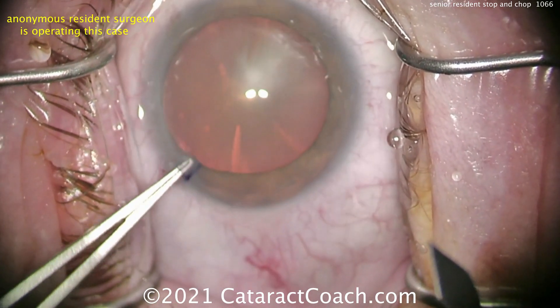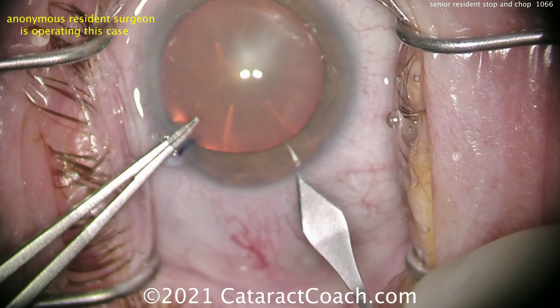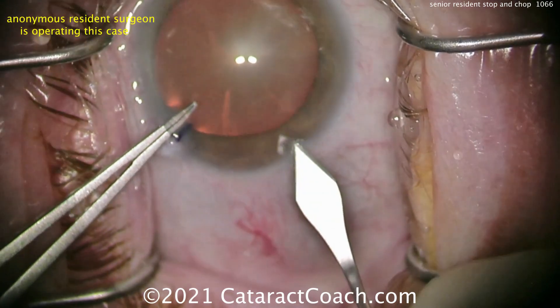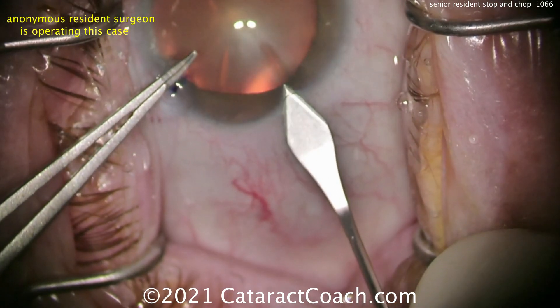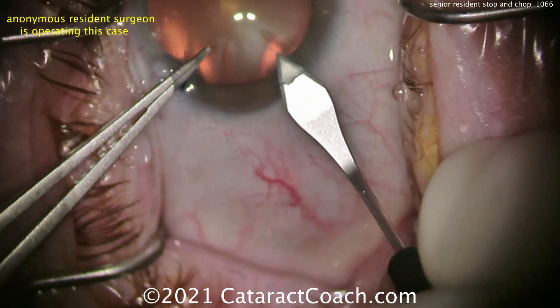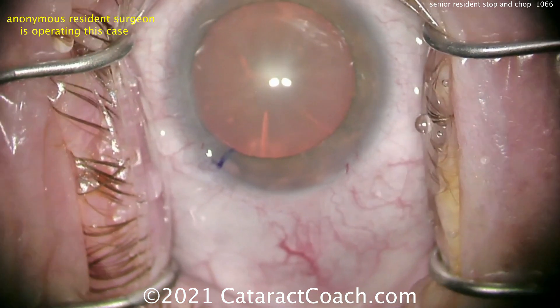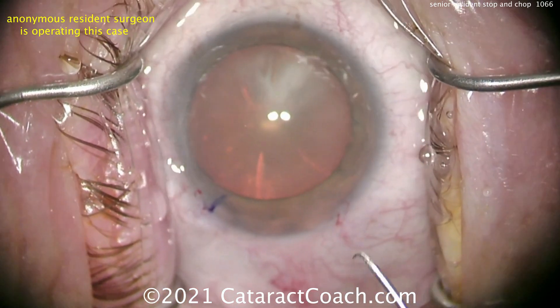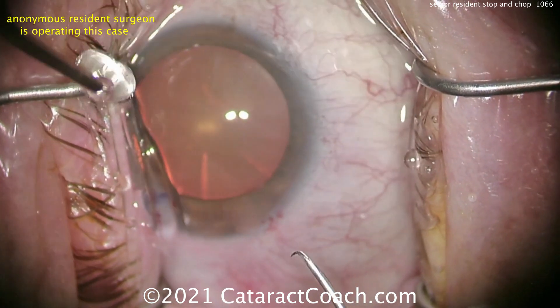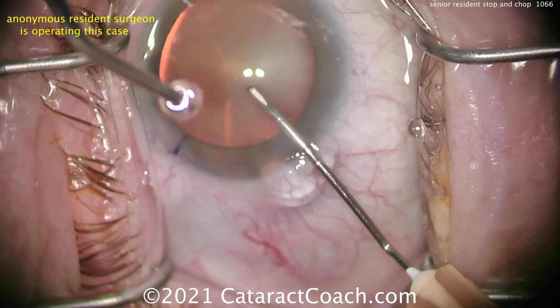Now fixating the eye with some forceps to the paracentesis, and here comes the keratome. Let's look at that main incision — entering the limbus area pretty nicely, advancing it, good tunnel length. I like the incision. It's just a little bit too anterior for me, but you still hit some limbal vessels. That's a darn good incision. For 160 cases in, that's definitely an A.